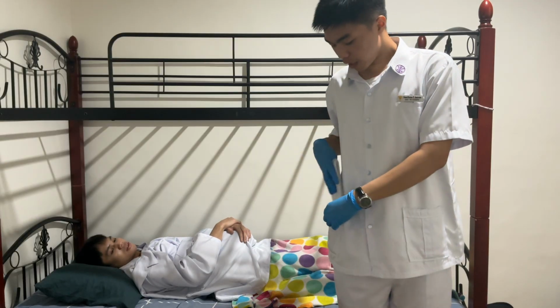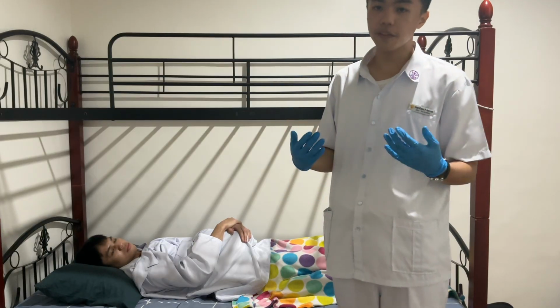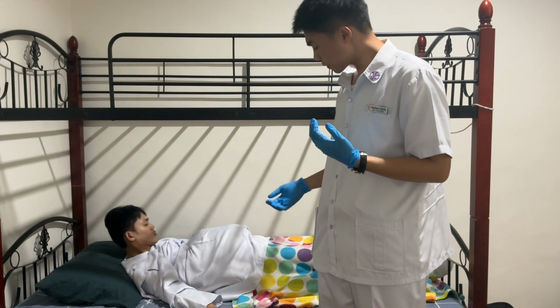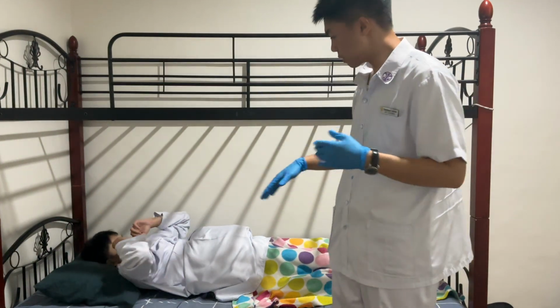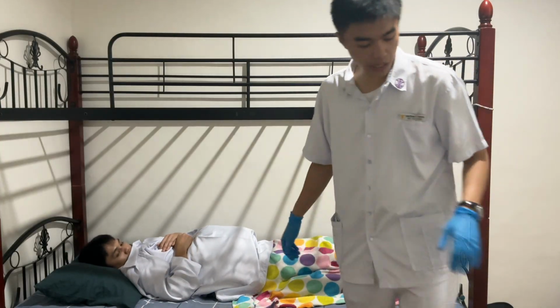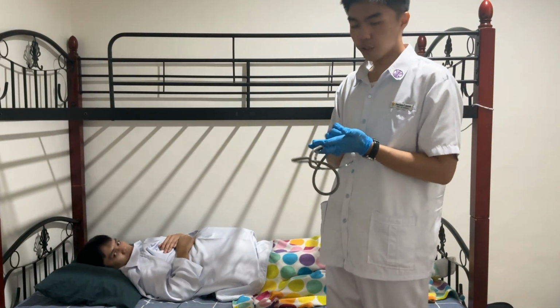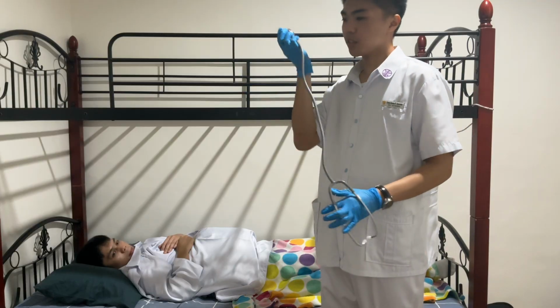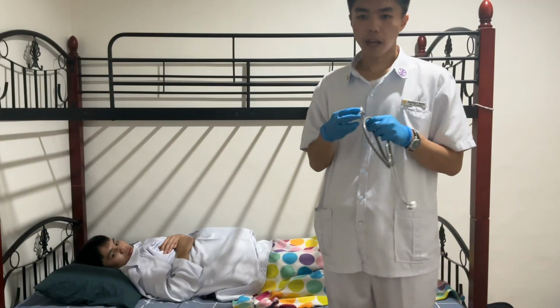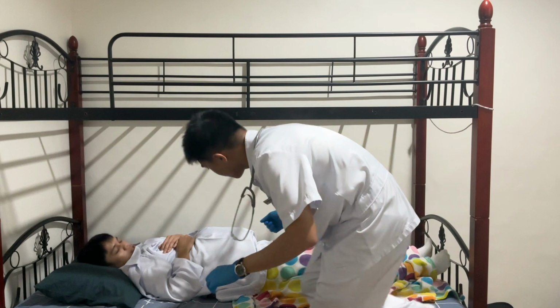So upon checking for the fetal heart tone, we just have to remember that it is on the left, and it is a cephalic presentation. So the fetal heart tone is near the head, so it is going to be in the lower quadrant or lower part of the abdomen. Okay, so I'll just prepare my stethoscope and ensure that the stethoscope is not too cold. Just going to warm it. We'll be using the bell because we're listening to a deep sound, the baby's heart tone. So once that's ready, I'm just going to expose again, ma'am. Okay.